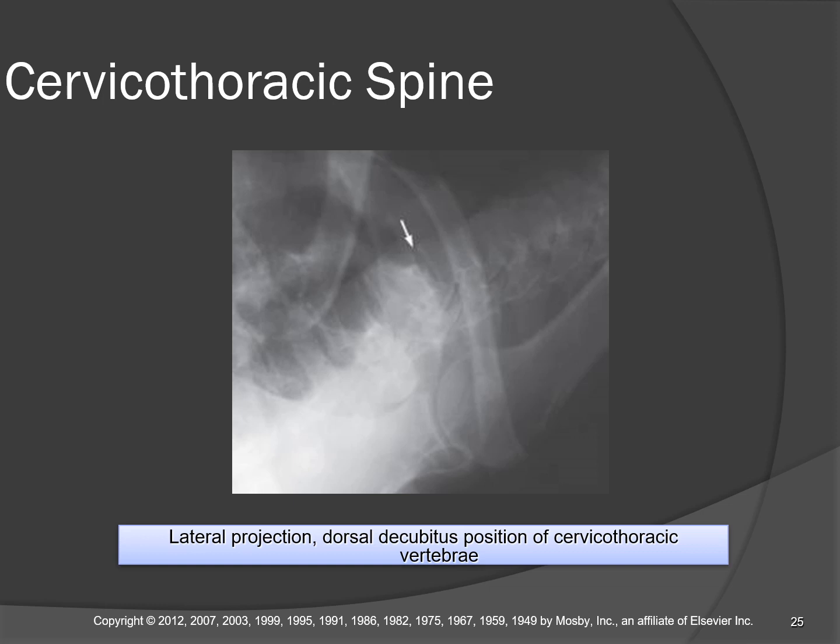We do need a true lateral or close to a true lateral cervical thoracic spine. Okay. Vertebral body of C7T1. Intervertebral disc space should be in the middle of the radiograph. Okay. Elevated arm posterior, yeah, that's fine for this one, for a recumbent one.